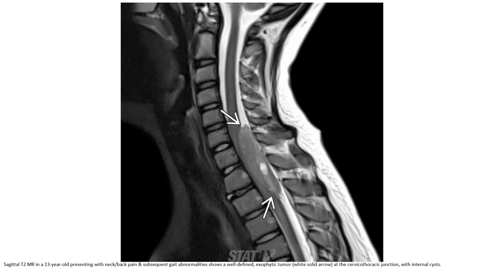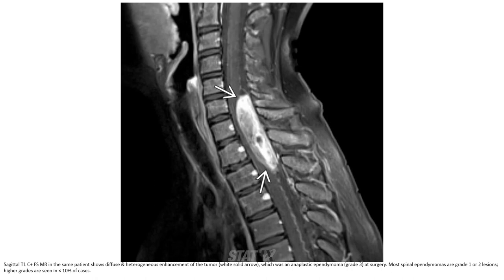T2 MRI in a 13-year-old presenting with back pain and subsequent gait abnormalities shows a large cervicothoracic junction tumor with intrinsic signal change. T1C+ MRI in the same patient shows avid and heterogeneous enhancement of the mass, which was confirmed as a high-grade ependymoma at surgery.